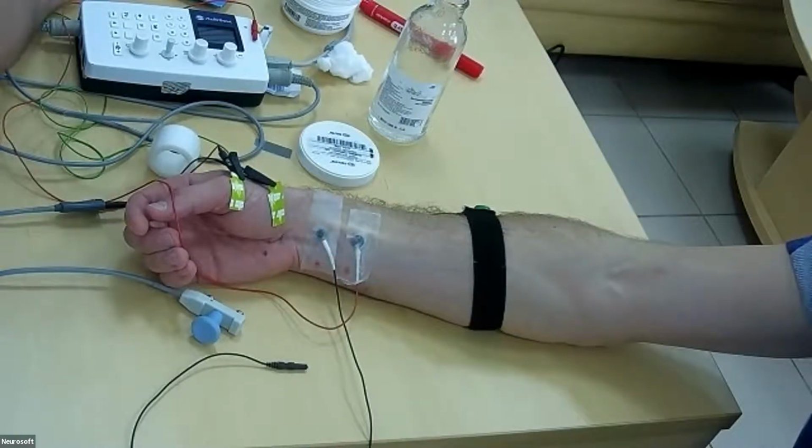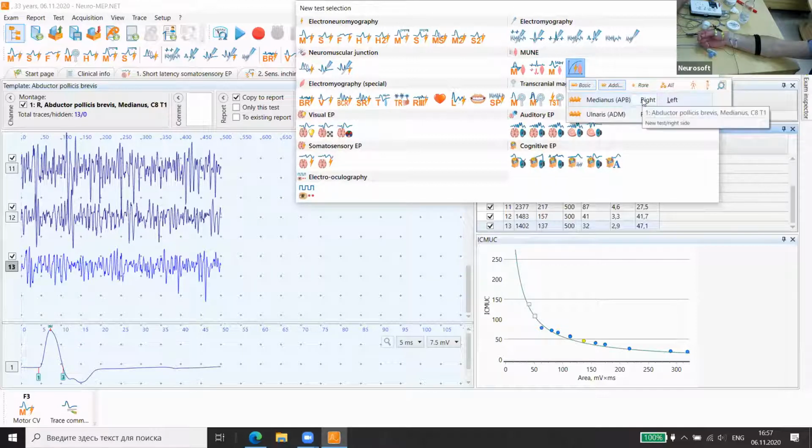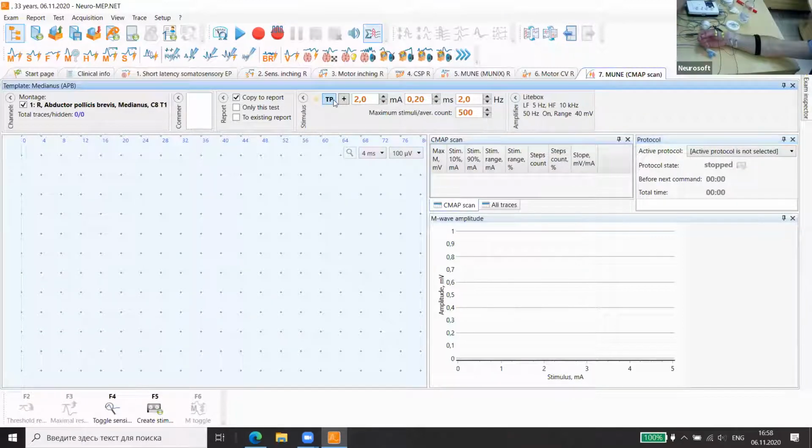So now we can go to our new second, again, median nerve, right? So this method is connected with stimulation. We set it with touch proof, or you can use classical DIN stimulation. Now we will set DIN, change to touch proof.